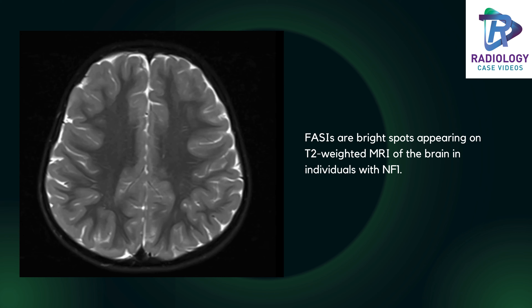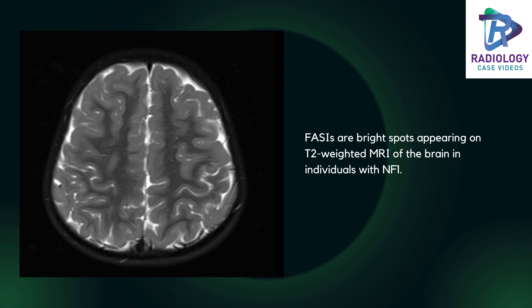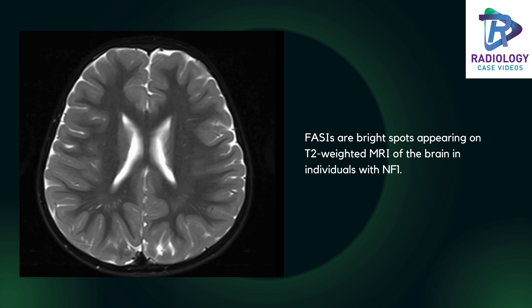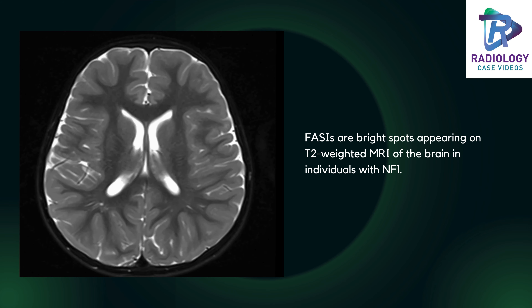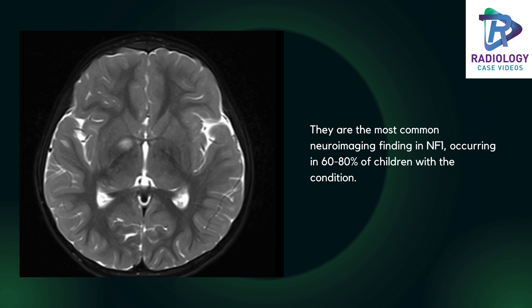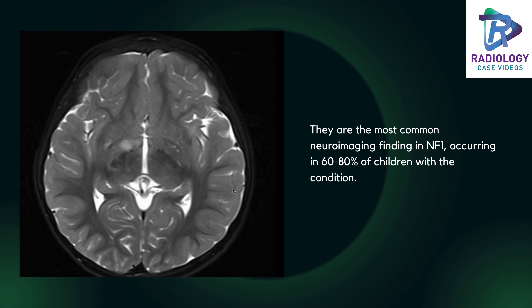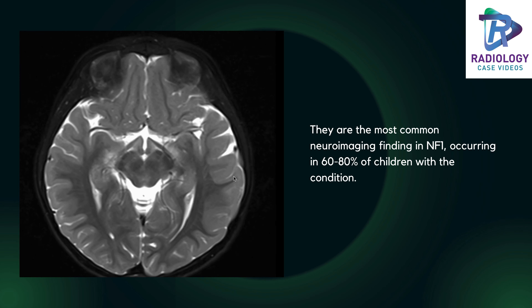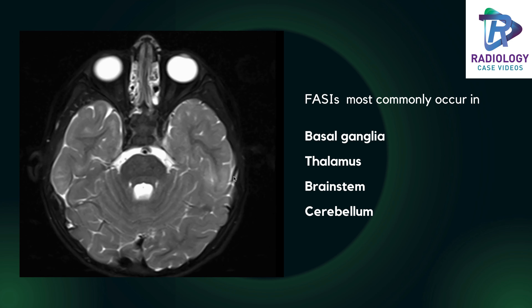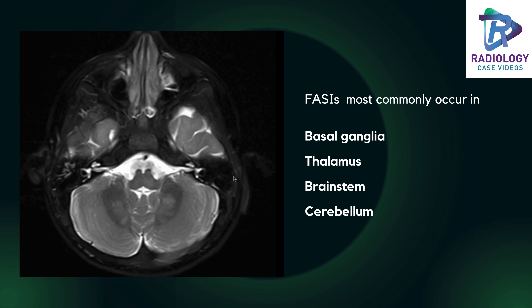This is a 10-year-old child with café-au-lait spots referred for MRI brain due to poor scholastic abilities. Here in the globus pallidus on the right side, you are able to see a hyperintense lesion. You could also appreciate a few hyperintense lesions in bilateral dentate nuclei.